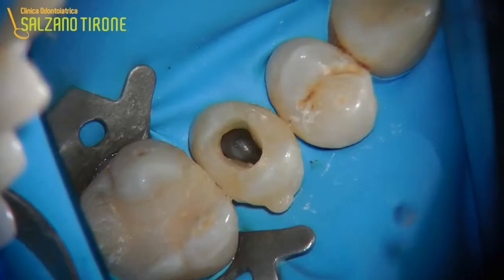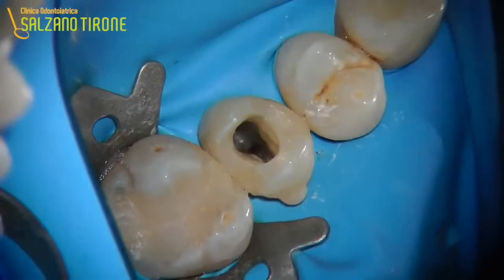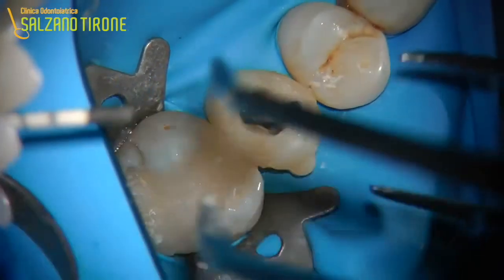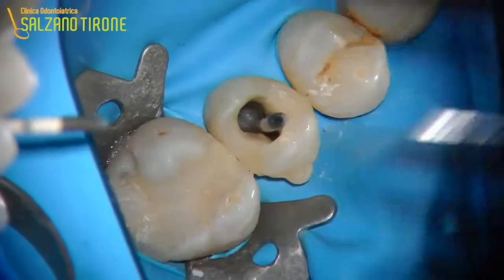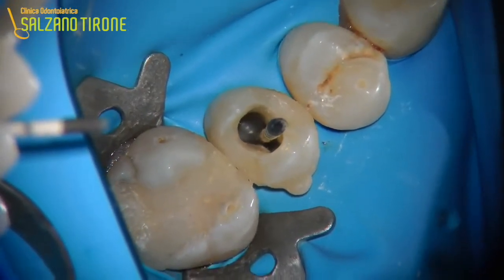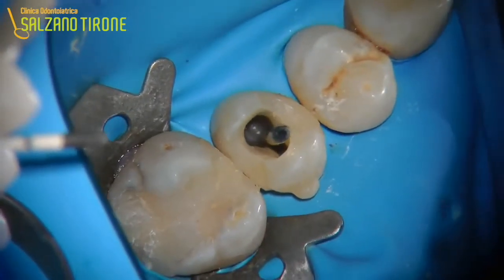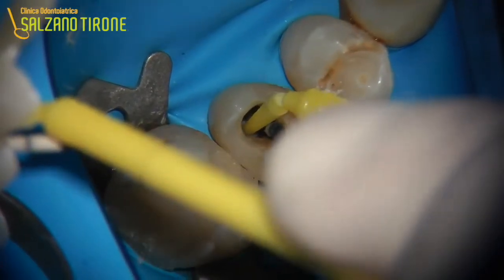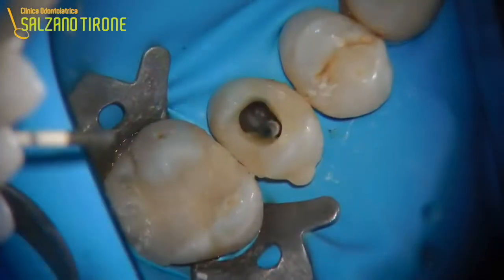I think that actually several methods can be used. For instance, in some cases I've used biodentin, as I mentioned in my post, but here I use the classic MTA. To prevent MTA from dripping into the root canal, I'm placing a paper cone in the main root canal, which was just one in this case, and I'm creating an ischemia with 36 volumes oxygenated water into the defect, as you can see right now, to prevent it from bleeding when I start placing the MTA.